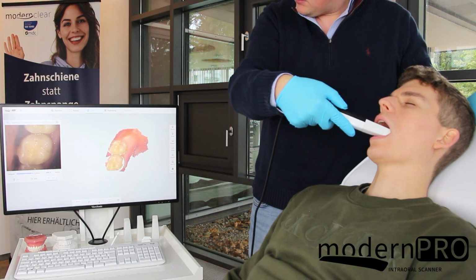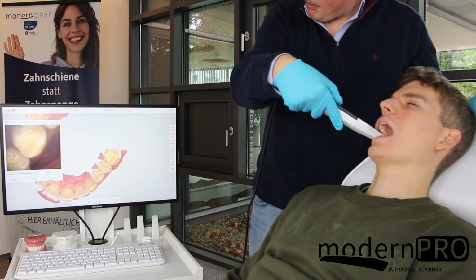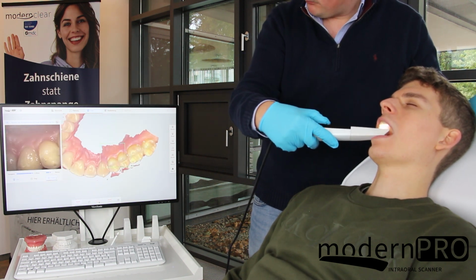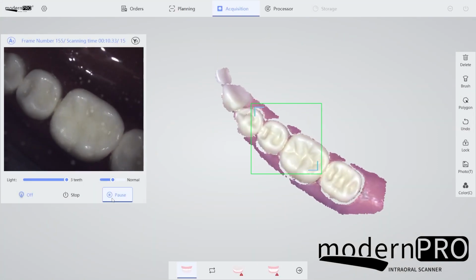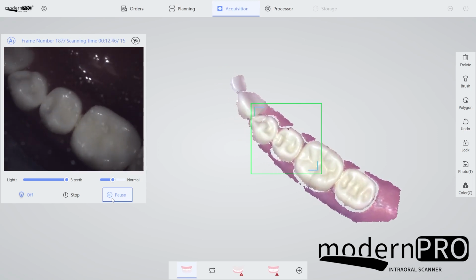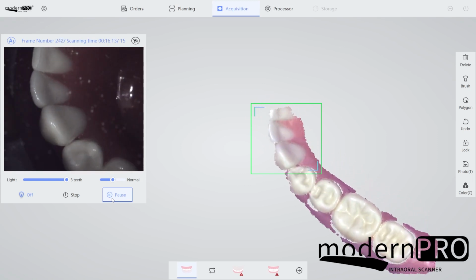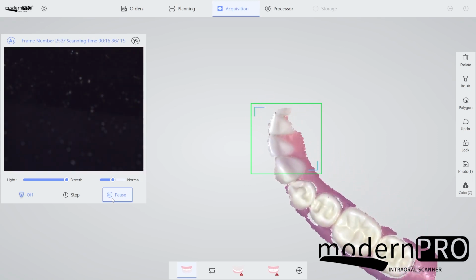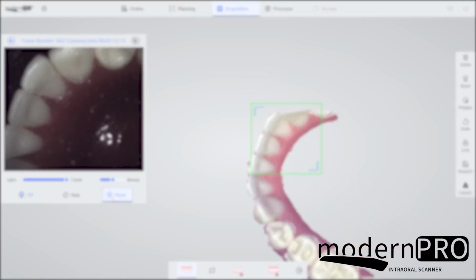So first things first, I scan the arch or the bow of Josh's teeth. After that, I can quickly scan the inner area of Josh's mouth. For me as a user, the scanner shows that it has established a connection with the teeth by making the formerly red square appear green. If it loses contact, it becomes red again. After having re-established contact, it turns green again.